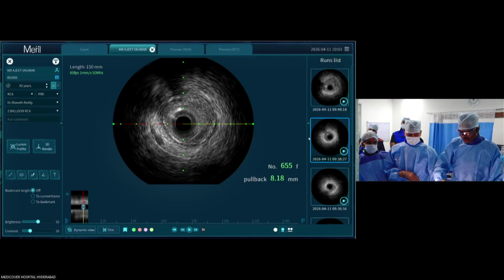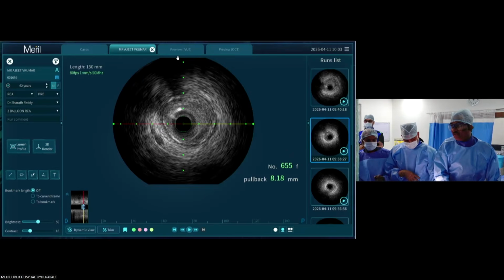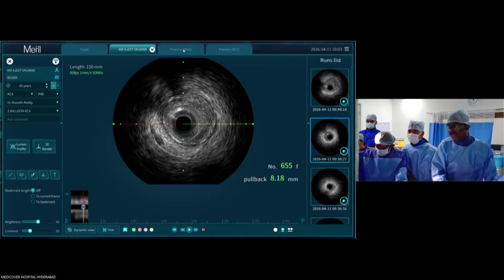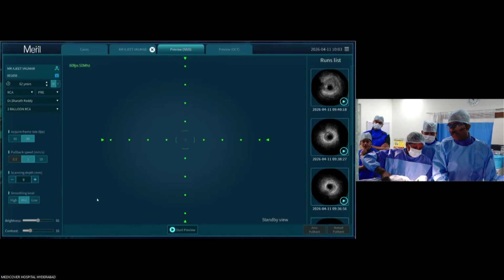Next, now I'll show you the IVUS after balloon dilatation with the 2 mm balloon, and let's see how the distal vessel is. And most important here is how the flap at the stem of the RV branches. Do I need to do something to the RV branch?